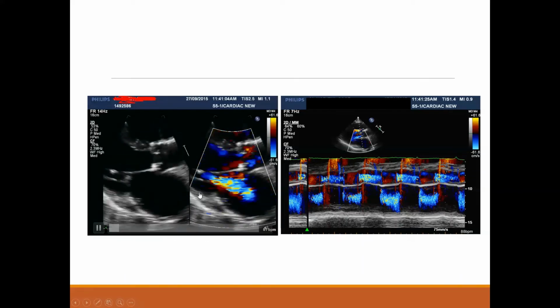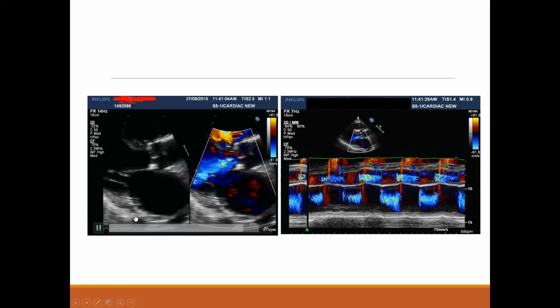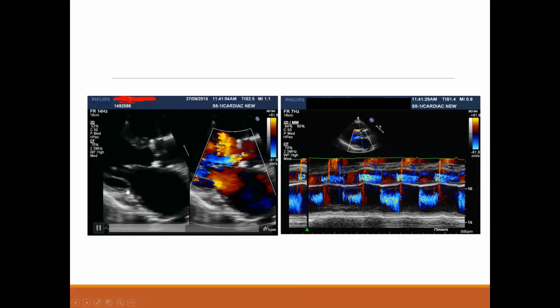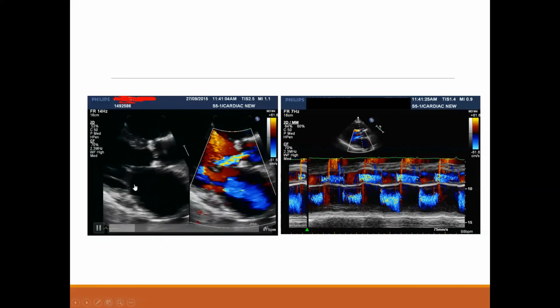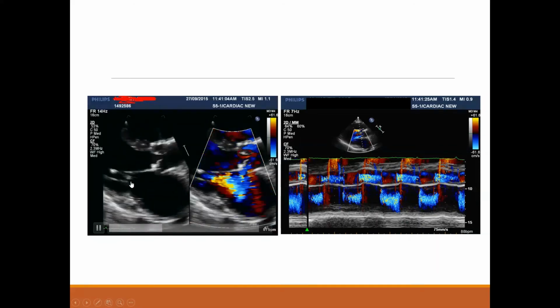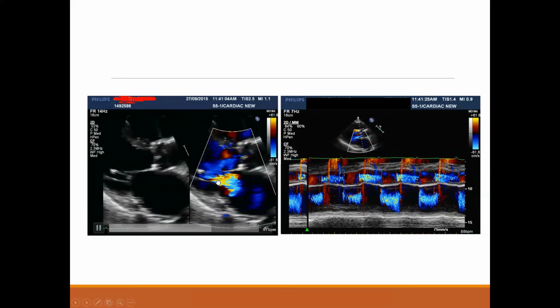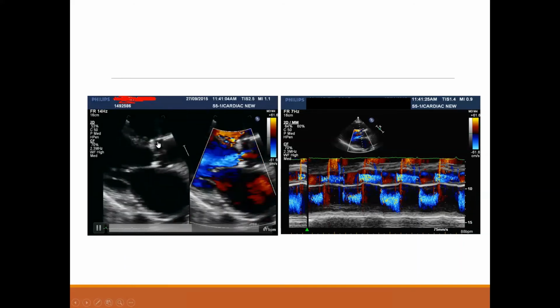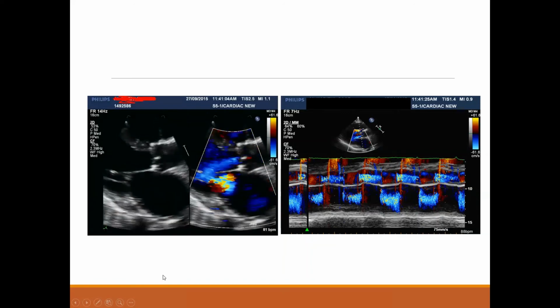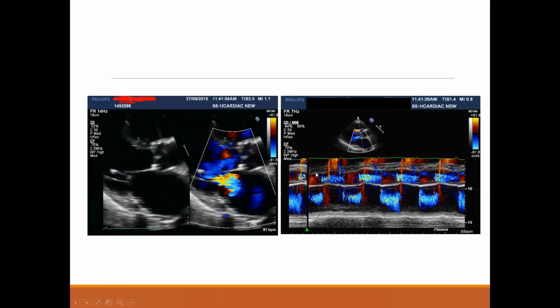And by the way, this is the same patient, but zoomed in. Look at the posterior wall. It's akinetic here. Look at the posterior leaflet. It's tethered and not moving well. The anterior is moving well. There is effacement and probably a coaptation defect, and there is a central jet of mitral regurgitation. Sometimes it's central, sometimes it tends to go more posteriorly, like we said. And the degenerative changes in the aortic valve we appreciated in the former slide are associated with aortic regurgitation.